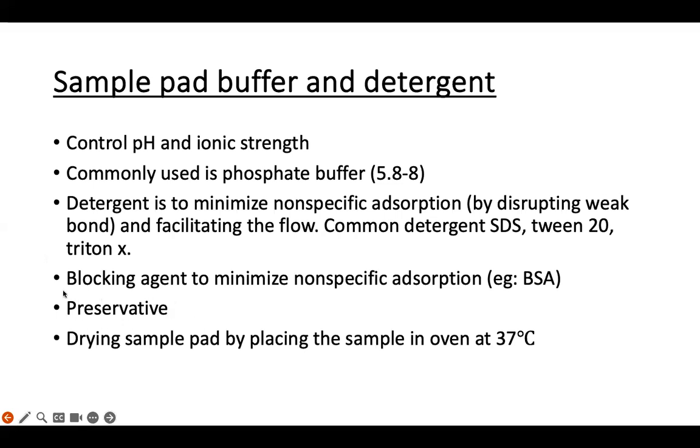Sometimes we use preservative because we need to keep the lateral flow for 1 year. Okay, so we need to put some preservative, but right now, because we prepare most of the time freshly prepared, we don't use preservative. And drying the sample pad by placing the sample in the oven. This is a very crucial step.